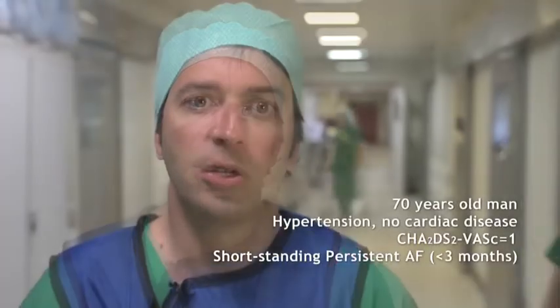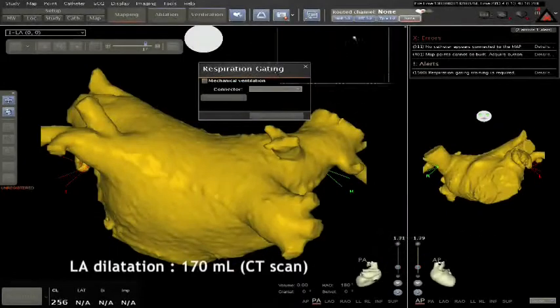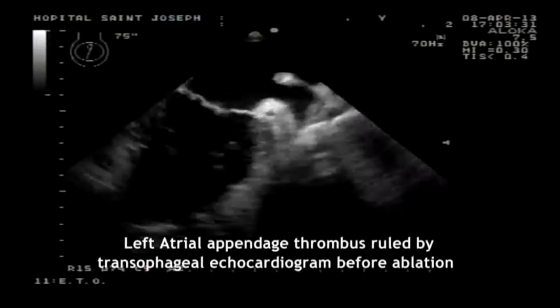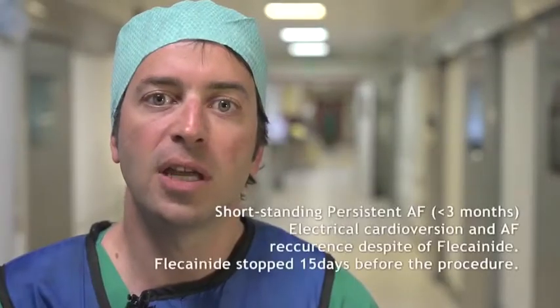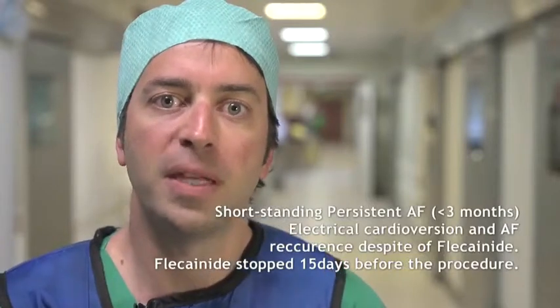So the case presented today is a 70-year-old man with symptomatic drug-refractory persistent atrial fibrillation. This patient had no structural heart disease, a CHA2DS2-VASc score equal to 1. The left ventricular ejection fraction is normal and the left atrium is a little bit dilated. An electrical cardioversion was performed 1 month ago, but the patient experienced atrial fibrillation recurrence. The patient is right now in atrial fibrillation, and we will perform an electrogram-based substrate ablation of his atrial fibrillation.